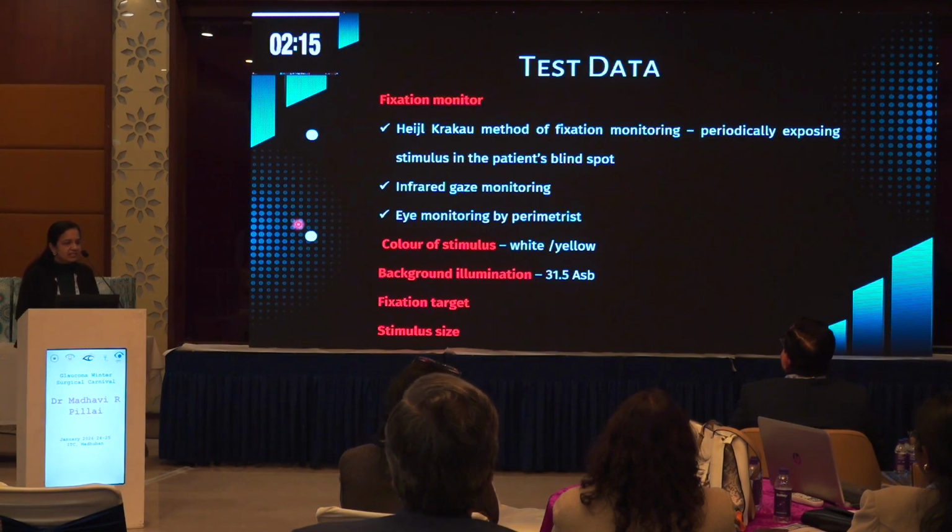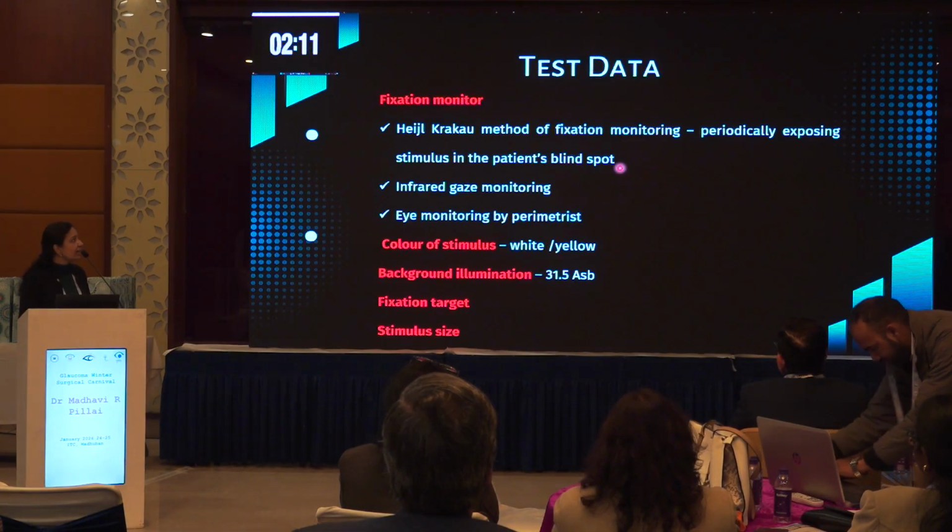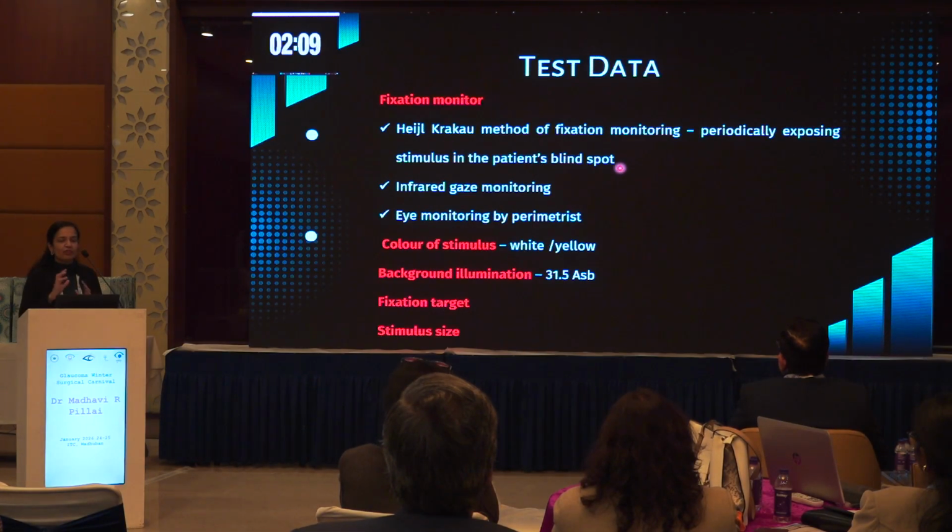So next is the test data. The fixation is being monitored by 3 things. That is the Heijl-Krakau method of fixation monitoring. What happens is that periodically a stimulus is presented to the patient's blind spot. If the patient responds in the blind spot, that means the patient is not actually fixating.